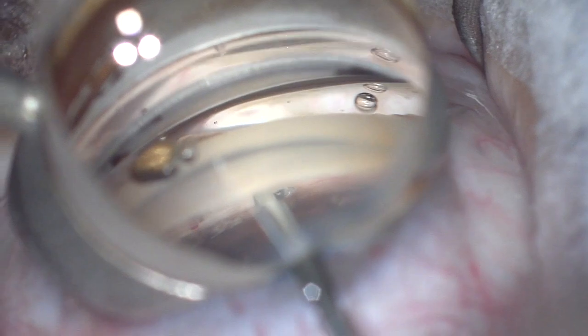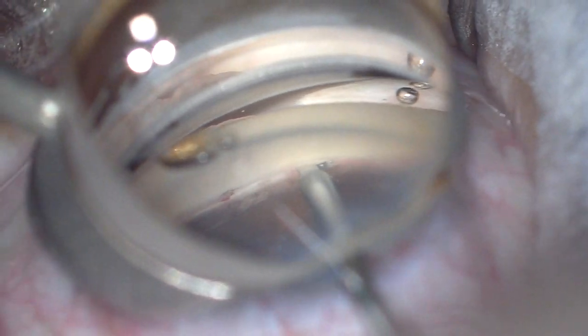We then rotate the blade 180 degrees and go back in the opposite direction. After this, you'll see I'm going to inject some viscoelastic — this will help separate the leaflets of the trabecular meshwork and further expose Schlemm's canal, further illustrating the goniotomy that we have performed.